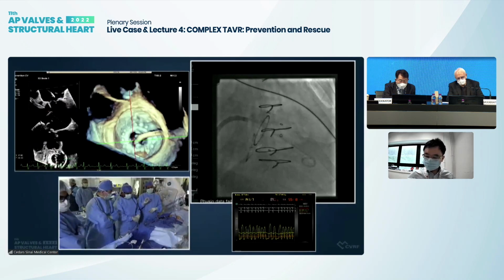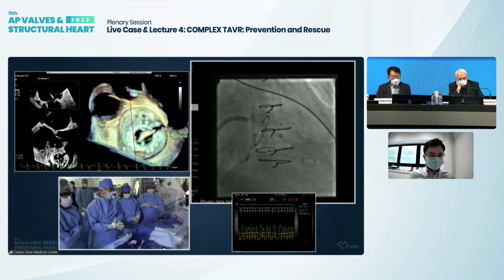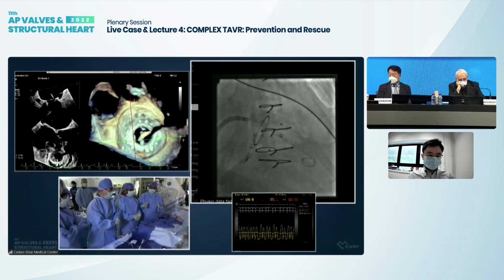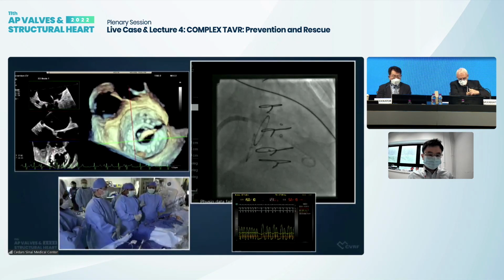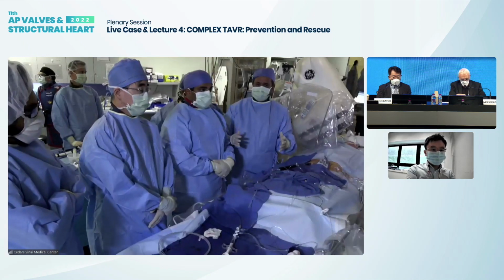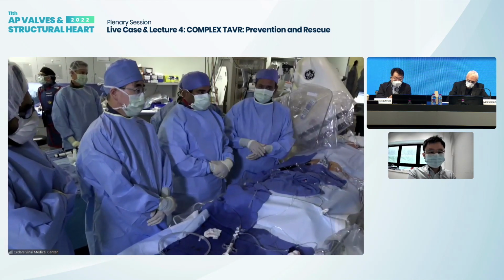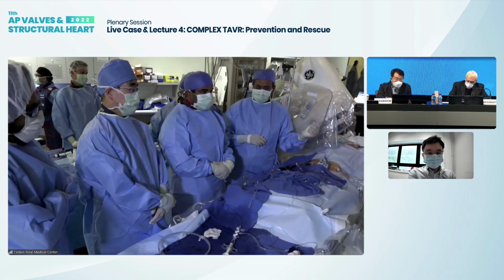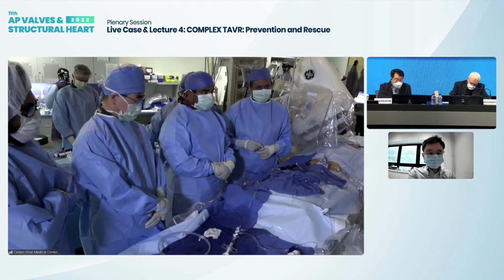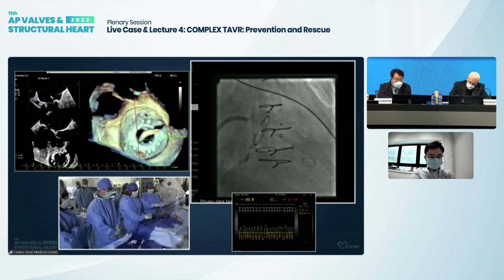Now, the other important thing is that when we have mitral regurgitation through the valve, often we may not appreciate paravalvular leaks. We've had situations where there is so much valvular regurgitation that we don't appreciate the paravalvular leak, and then we put the valve in, we actually see that there is a PV leak as well, and then you have to deal with it. It seems unlikely here given the careful imaging done by Sid and Moody, but we'll see what actually happens. So can we go and show the hemodynamics, please?